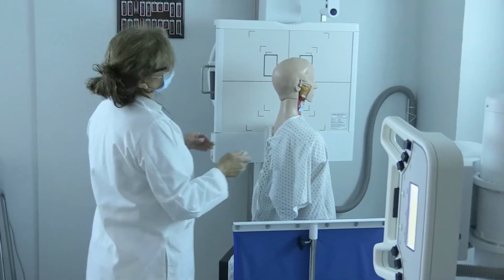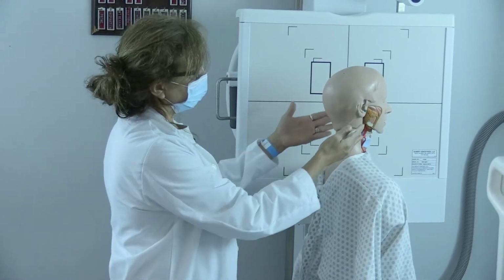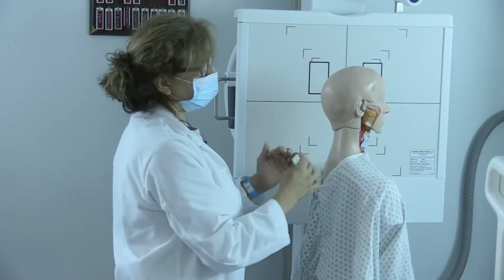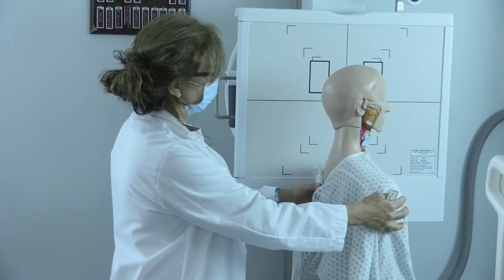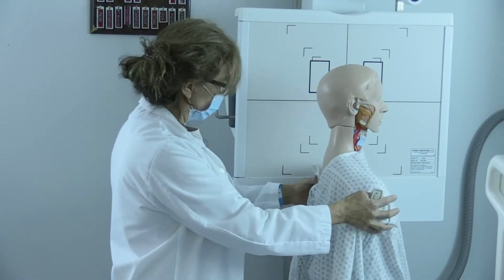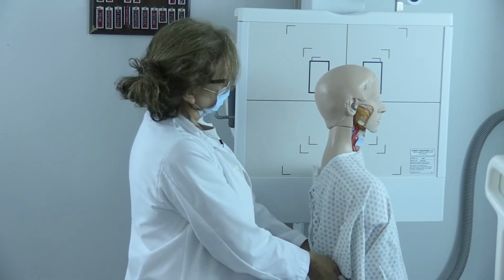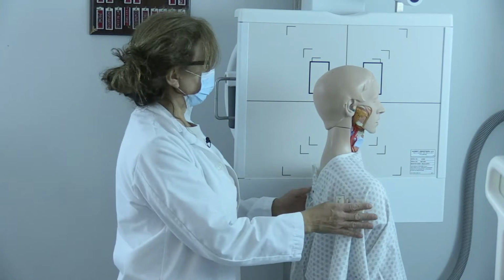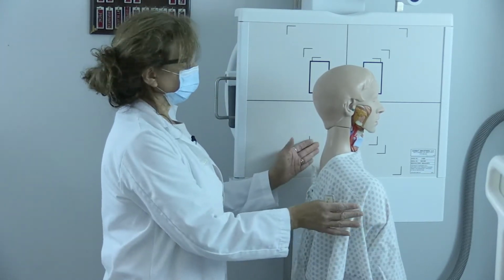I'm also going to ensure that my patient doesn't have any jewelry, necklaces, or anything in the area of interest before I take this image. And I'm going to ask the patient to stand nice and tall or sit nice and tall in an erect position and close to the IR.